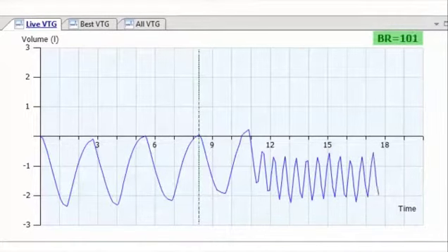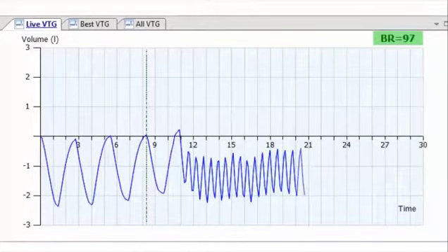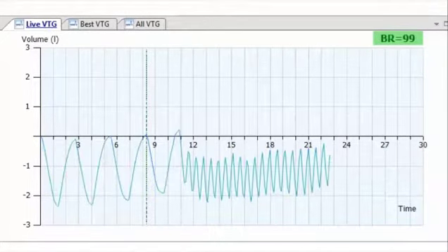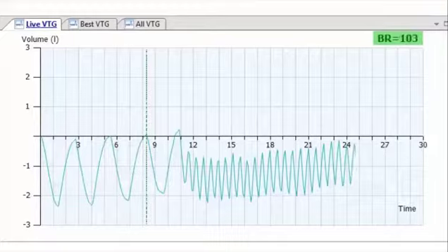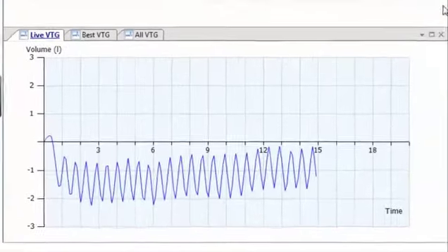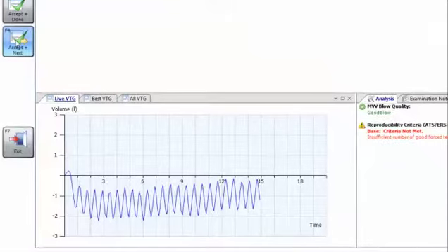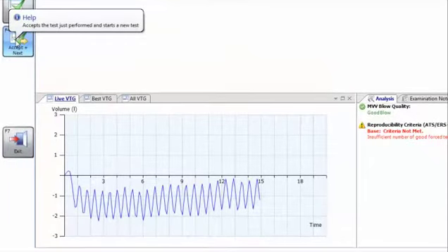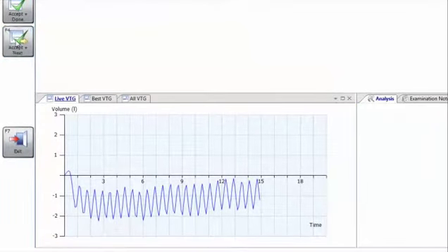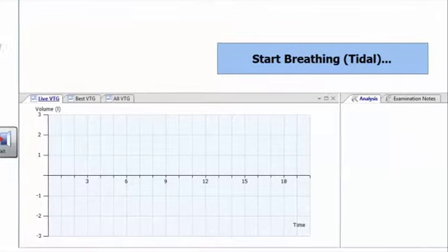The MVV in liters per minute will be displayed, along with the breath rate shown in red or green, dependent on whether the test maneuver was acceptable. Press again to repeat the test. The test can be stopped once the ATS-ERS reproducibility criteria has been met.